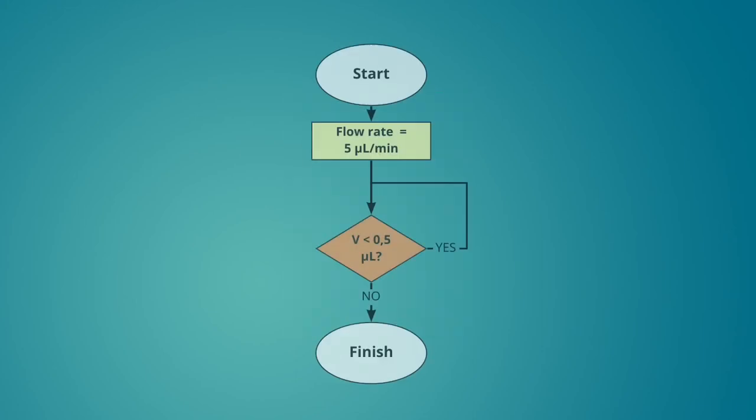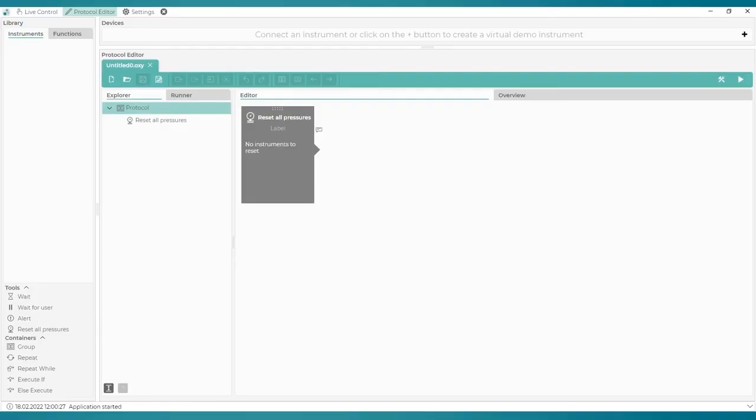This is what the logic of the new example looks like. We set the flow rate to an initial value and let the liquid flow until the volume reaches 0.5 microliters. Once this happens, the protocol is over. Let's create this protocol. We will again be using Lineup Simulation.